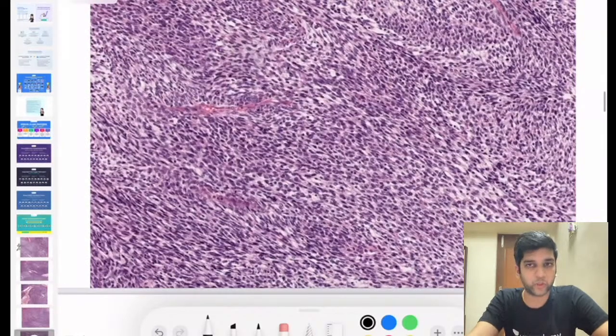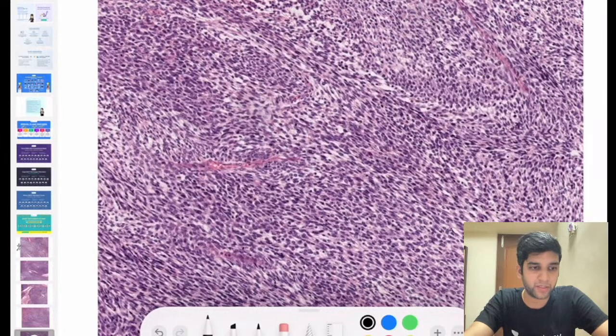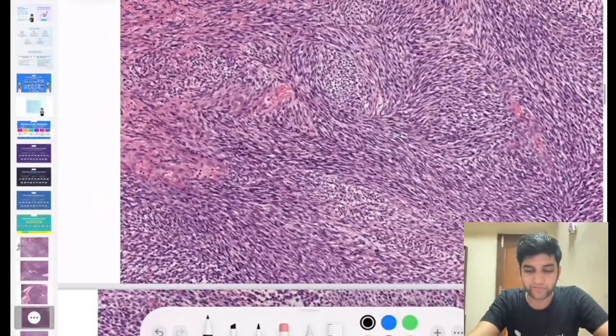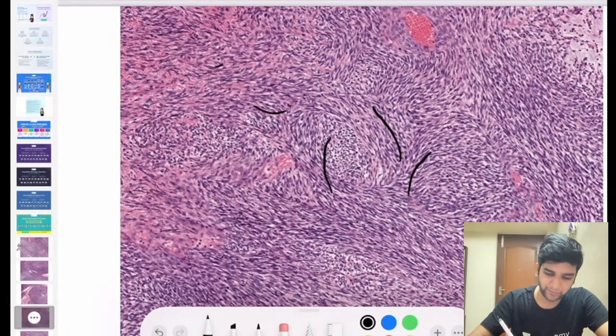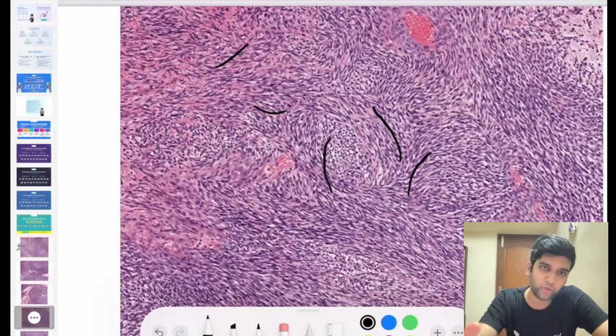The reason for going with synovial sarcoma is, one, the cellularity. See, ST is for soft tissue sarcoma. The cellularity is very abundant. Whenever you see any case of synovial sarcoma, the amount of cytoplasm will be very less. They'll be very jam-packed cells, right? And they are short fascicles. Though in this image, this kind of looks like a herringbone appearance, right? This appearance, though not exactly, does resemble a little bit of herringbone. So fibrosarcoma is definitely a differential diagnosis here.